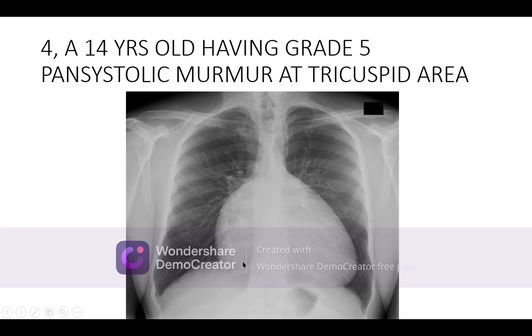Because of anything, Ebstein anomaly or other congenital abnormalities, it can be differentiated with echocardiography. That is the best way to do it. And you can also do electrocardiography to see the other parameters of cardiac function. All routine investigations should be done with this patient.